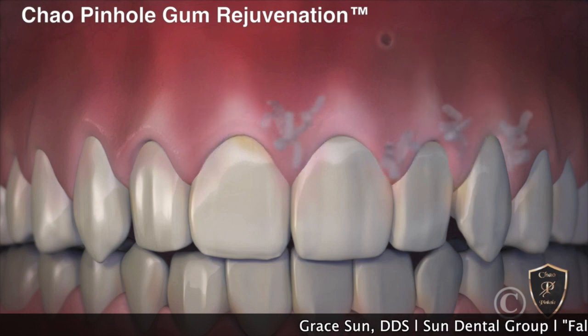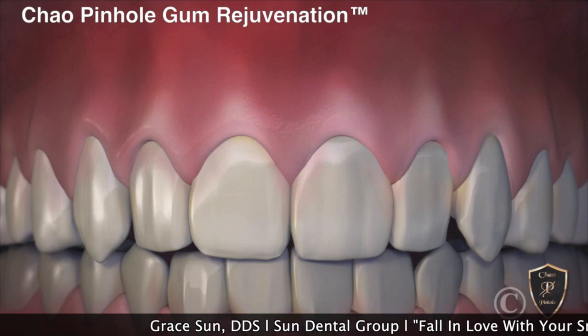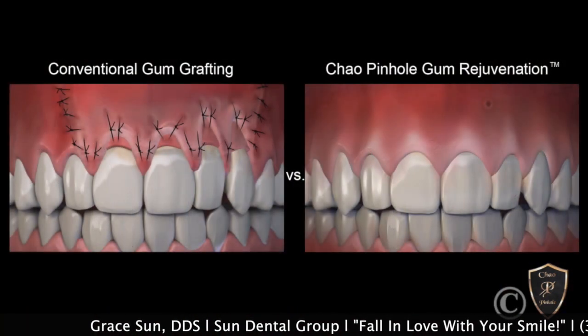So instead of sutures, we stabilize the gum with collagen strips. Now you can see the gum is being rejuvenated to the way it should be.